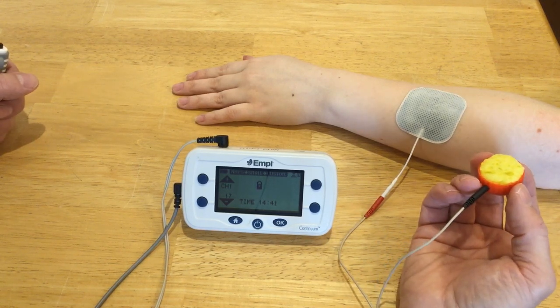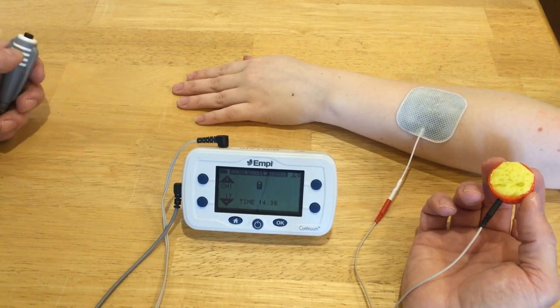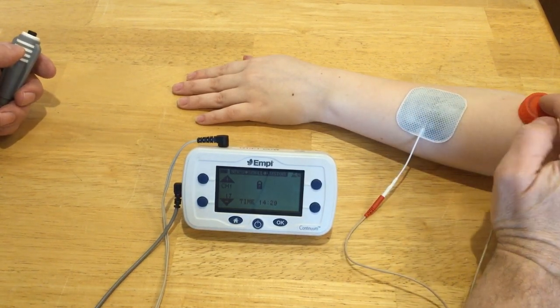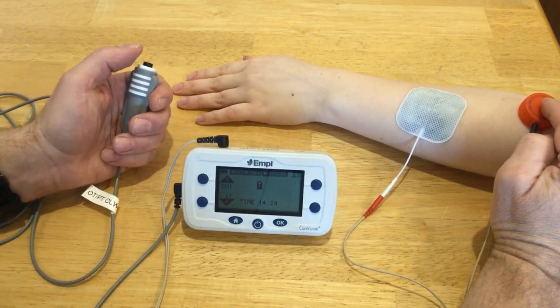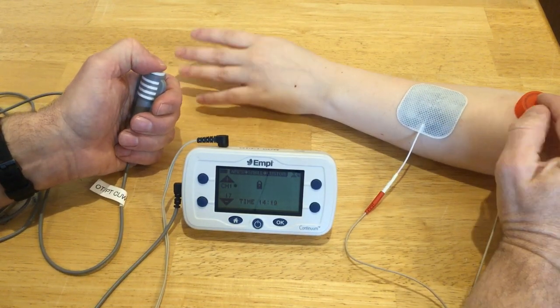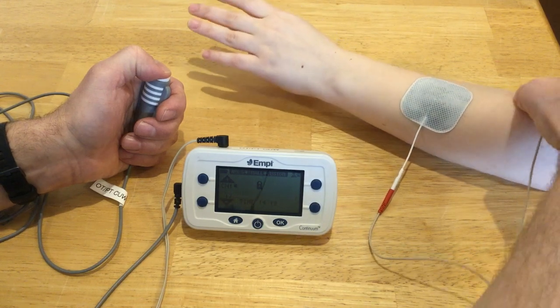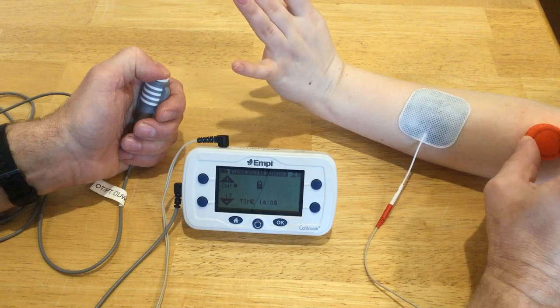You can also use tap water — it has enough contaminants in it that you can easily get electrical current through it as well. I'm going to apply this to my client, using my switch to turn the current on and off so I can easily control it. There we have a fairly nice wrist extension. If I go this way I get a little something else — a little supination. Now I'm getting more finger extension.